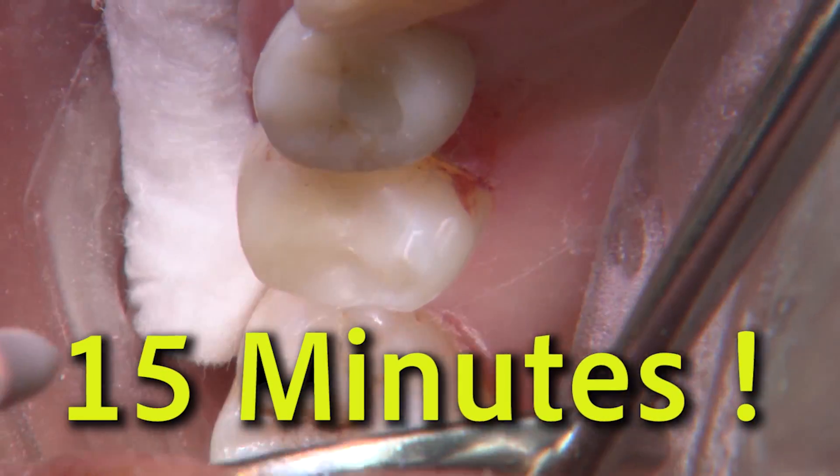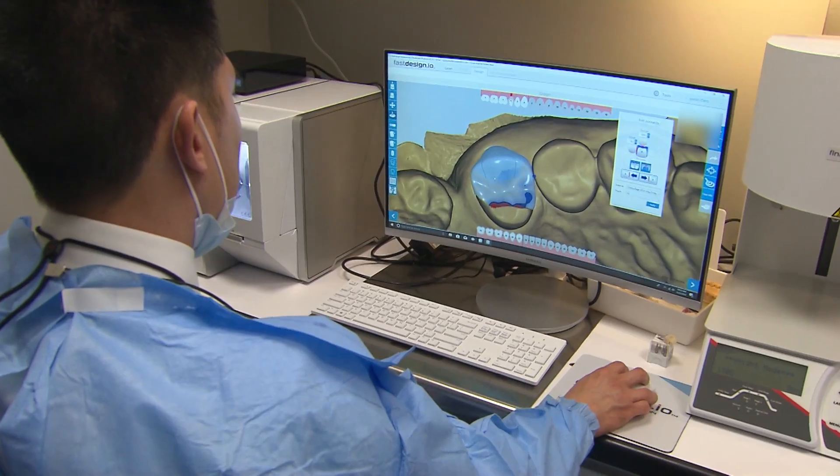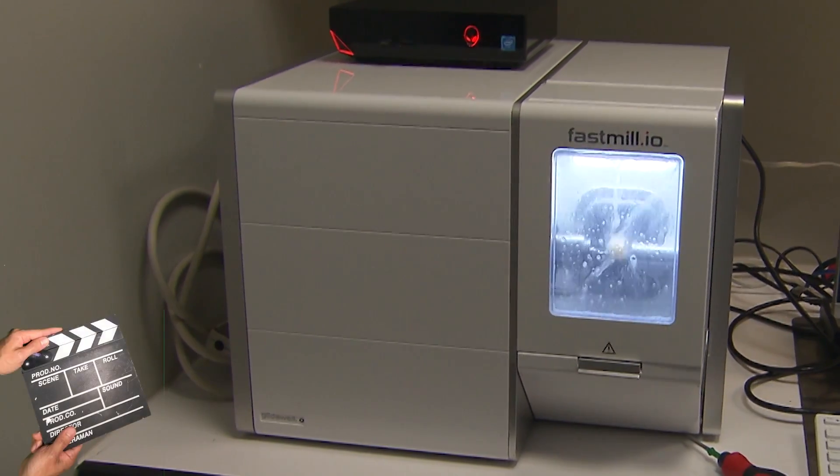In less than 15 minutes, we were able to scan, design, and mill this restoration using Camouflage Now.